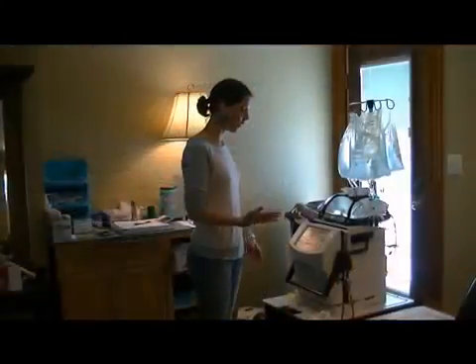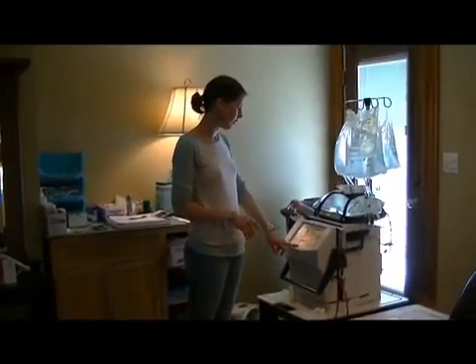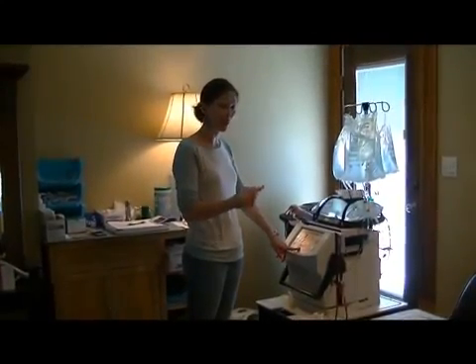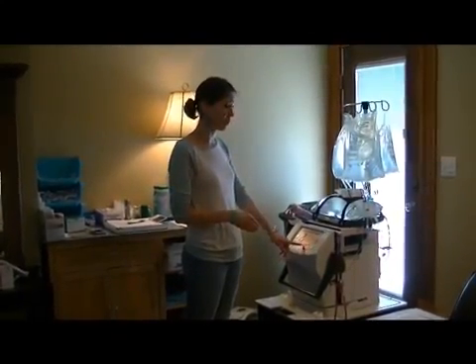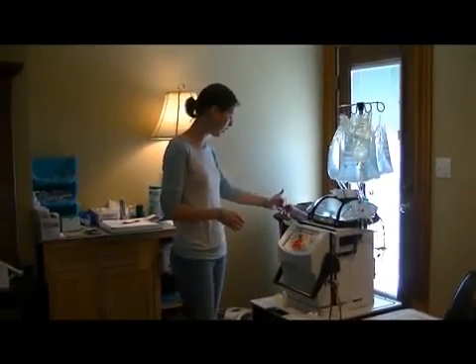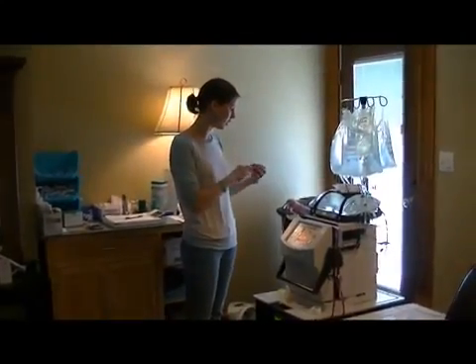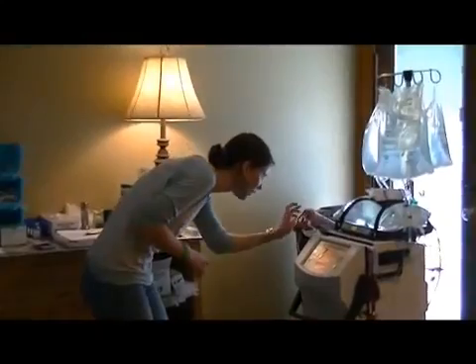So once we start, we always start at 200 milliliters per minute. And then after so long, you can slowly keep going up, because we go up to 500 milliliters per minute. And then you keep an eye on your filter here. This is where the dialysate and the blood are actually going in opposite directions, and that's where it's doing the filtering. And you have to watch for air in here.